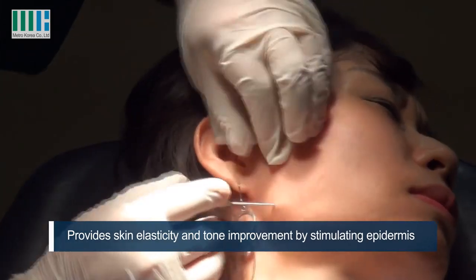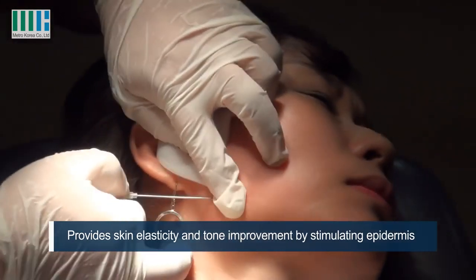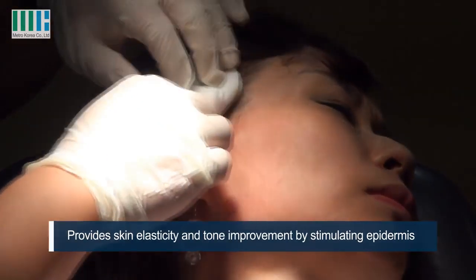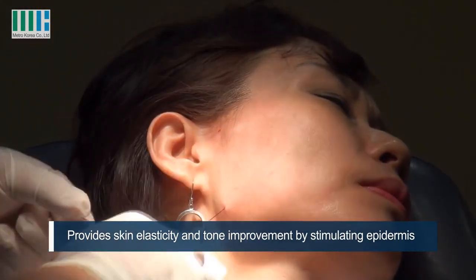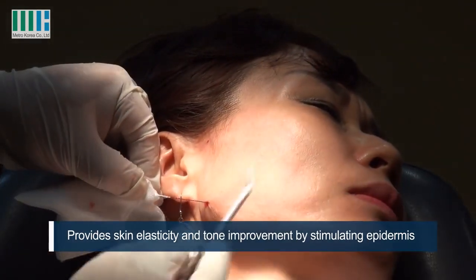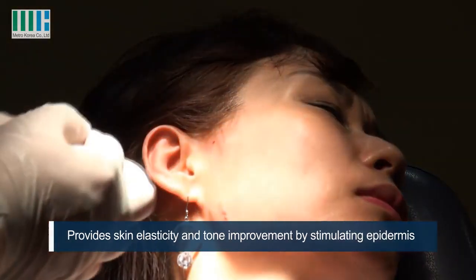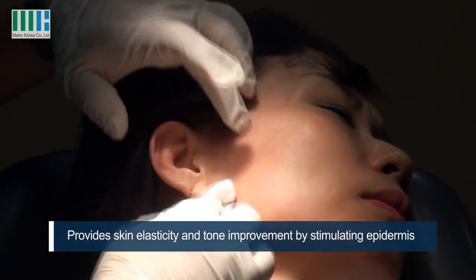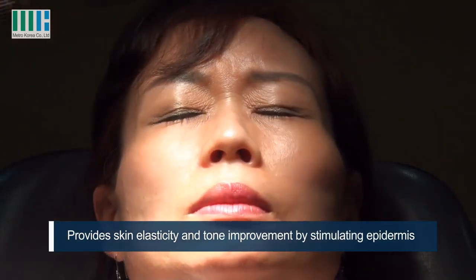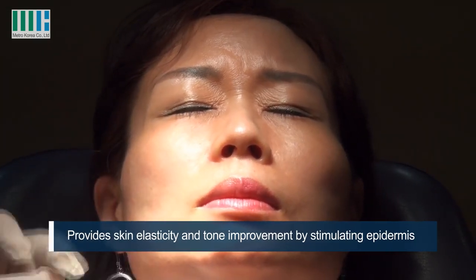So we're going to take this. This is a soft thread. One is here, one is here, and this one is the third. I'm going to use only one side here — I'm going to use three threads. One is here, one is here, and one is here in this direction.